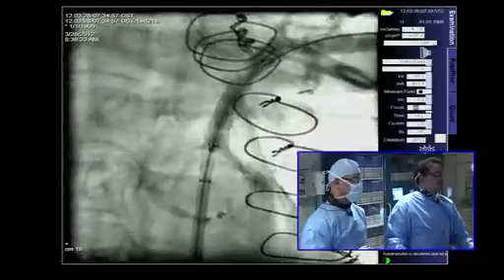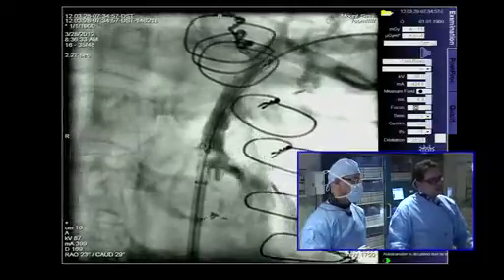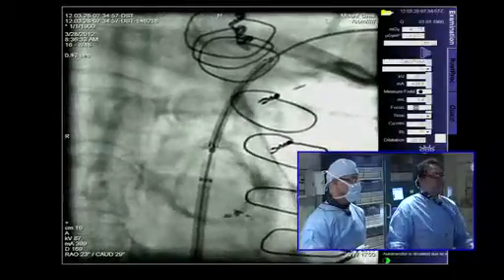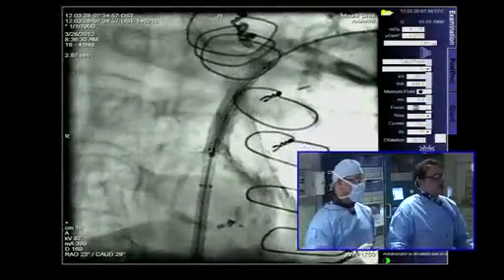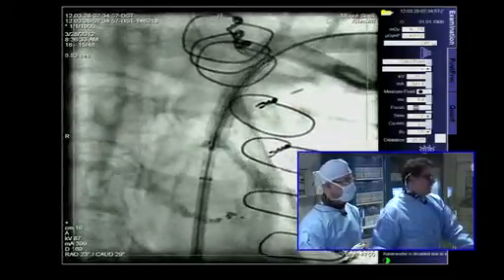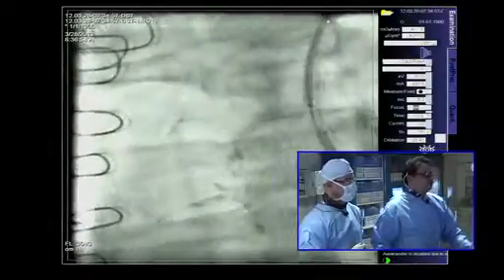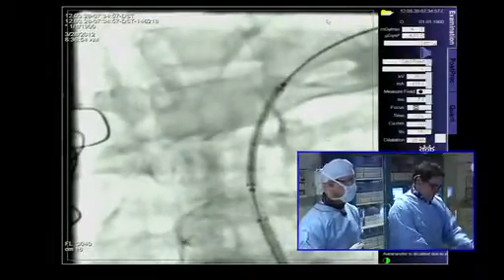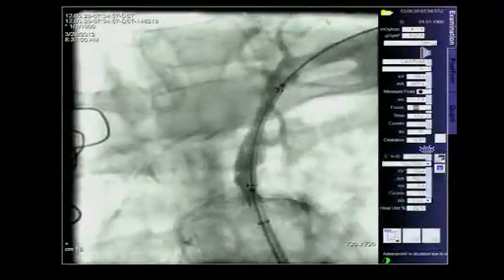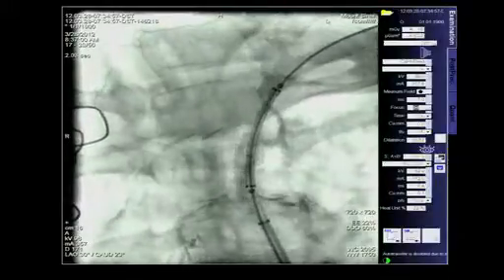You can see here, if you're trying to hit the ostium, you need to come back. But I want to demonstrate how beautiful it is for you to be able to see the extension of the aortic plaque into the subclavian. So this is RAO caudal, and you're able to see it. And the other view that you also need to always look at before you do ostial subclavian stenting is LAO caudal, and you'll see it here. Multiple different views for you to be able to see the ostium. And again, I'm going to have a little bit of injection here for you to see. So we're going to inject here. And you can see here, the subclavian also helps you where to land with the subclavian and with the vert.